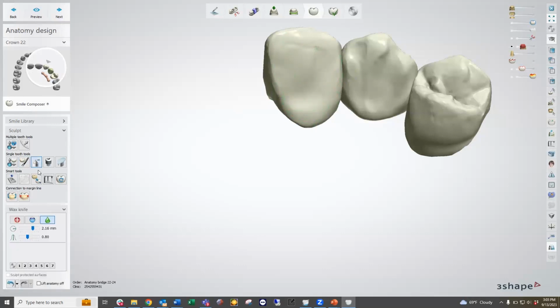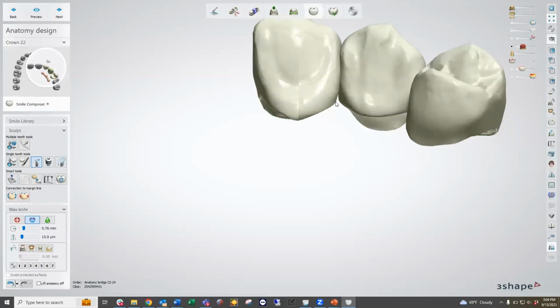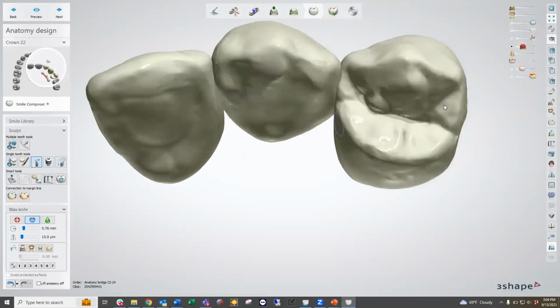If I wanted to design any sort of occlusal anatomy, I can with the subtraction tool. So I can go in and carve, like I said, with a nice strong line. Just design my anatomy. Okay. And then once I have that design, I'm going to go in about 2 clicks above, not as intense. I always make that mistake. And undoing is just a Control Z, which allows us to undo that. And then just subtracting that design. Maybe a little bit more intense.